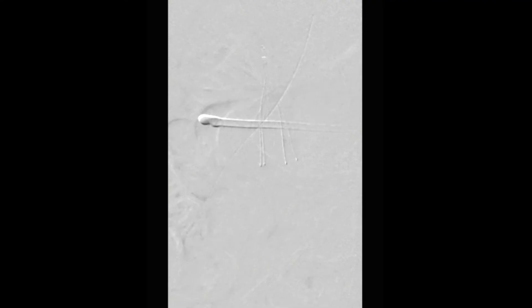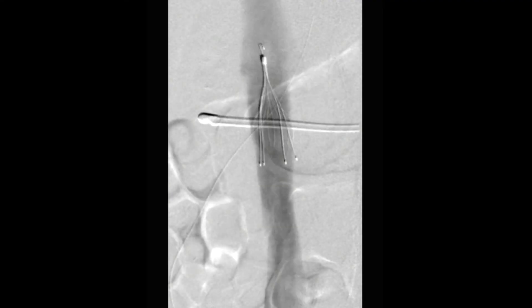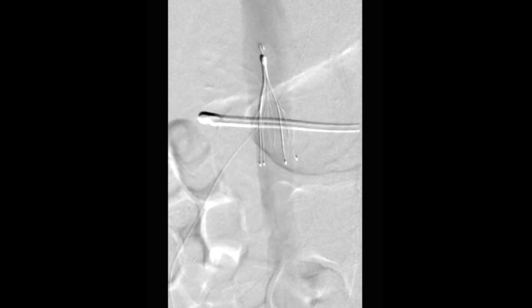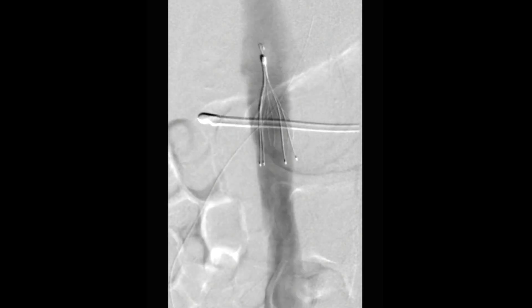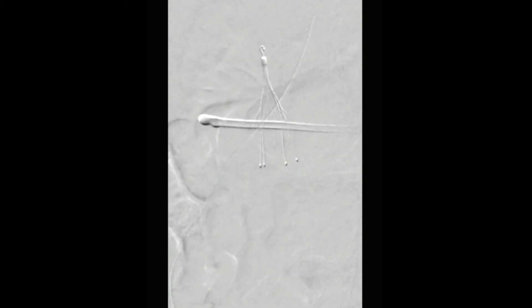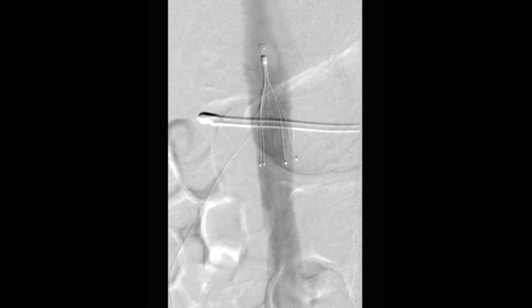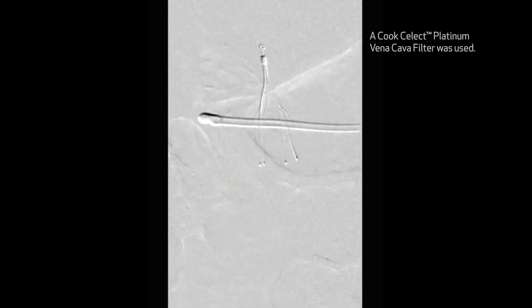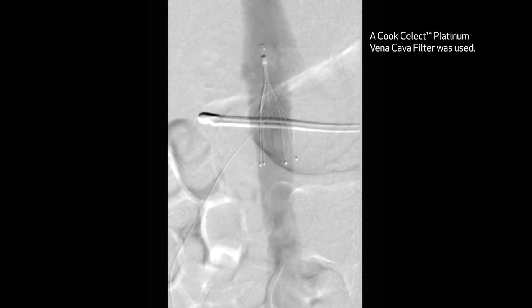A completion venogram is then performed that shows adequate deployment of the filter just below the renal vein and above the confluence of the iliac veins. This concludes our video demonstration of inferior vena cava filter placement using a Cook Select filter.